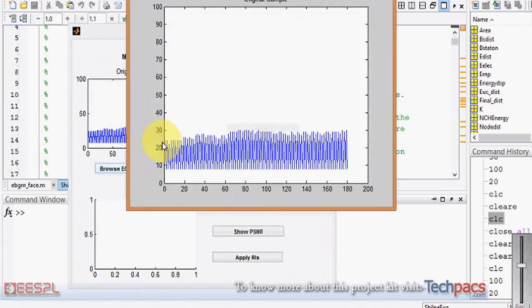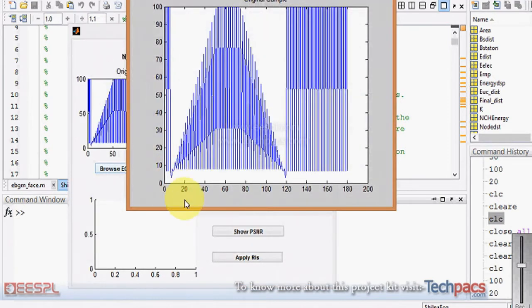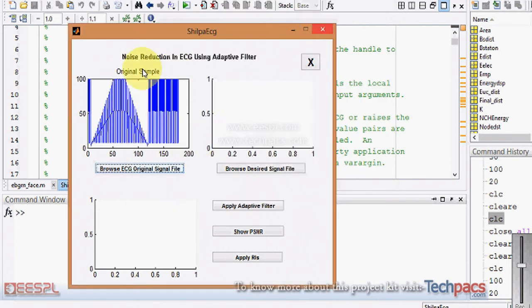I'm selecting one of the signals — this one — or you can browse any other one. These are a large number of values, so they appear very close to each other, but they are actually in the form of an ECG signal. This is the original sample which we have loaded.